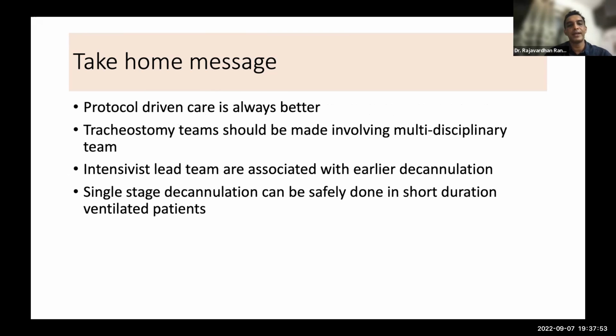Protocol-driven care is always better. Tracheostomy should involve a multidisciplinary team; an intensivist-led team is associated with earlier decannulation. Single-stage decannulation can be safely done in short-duration ventilated patients.